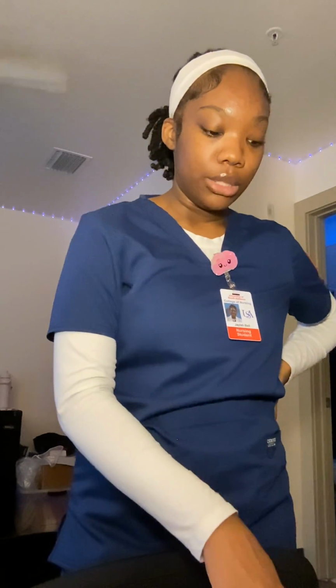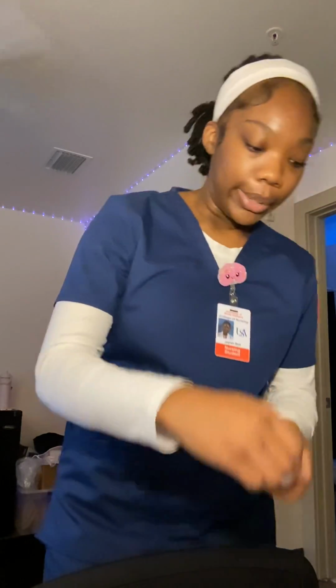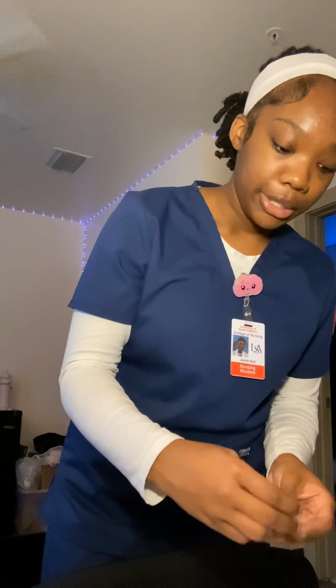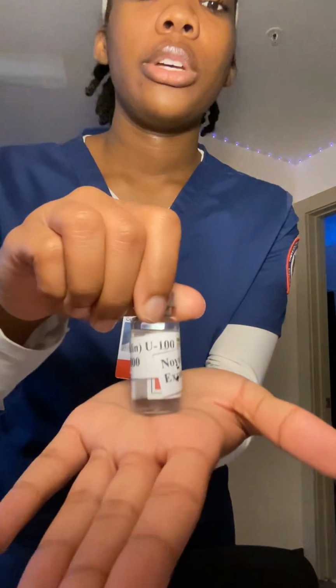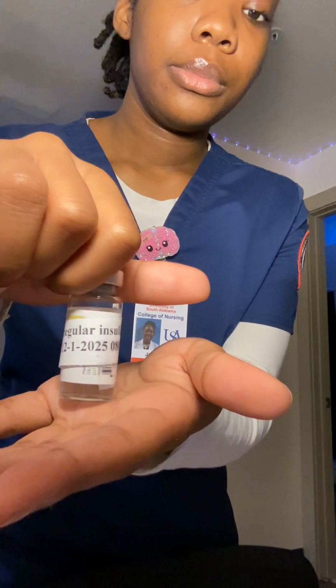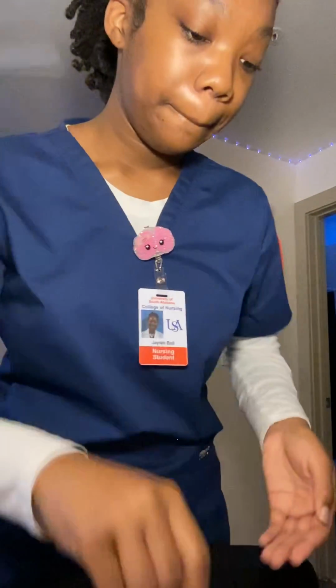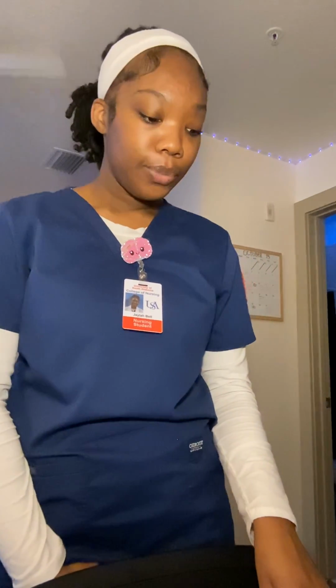For the right medication, we'll be giving Mr. Jones Novolin R, regular insulin. So I'm going to go ahead and find that. Novolin R, regular insulin, and it does match with his MAR. I see the expiration date is December 1st, 2025, so we're okay to administer. Just going to show y'all. This is the right medication. Okay. For the right route, we'll be given this subcutaneously.